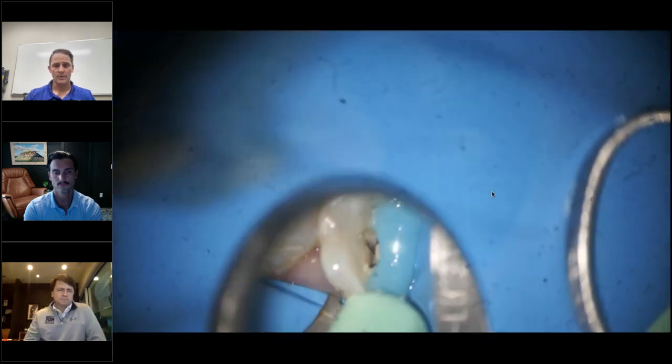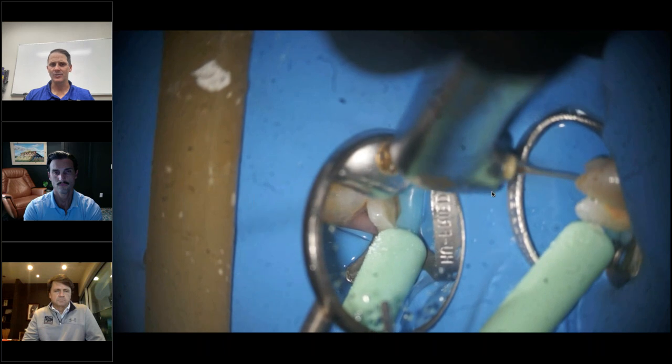So then we went through and instrumented, and now we're coming in here. We have our number 1 tip, and I've got water on right now. This is just in between the instrumentations. I go in there with water. You can use solutions as well if you like. You're in control, and you can determine what you want to do for each individual case.